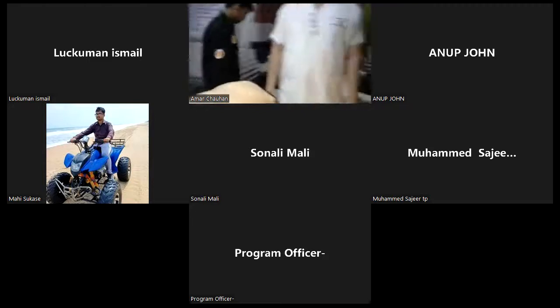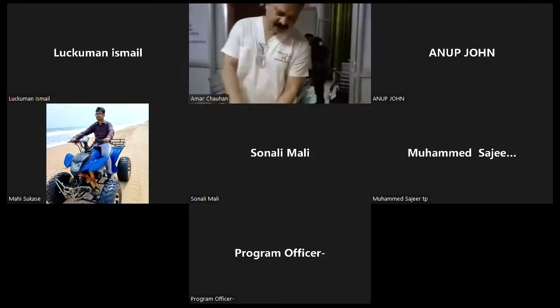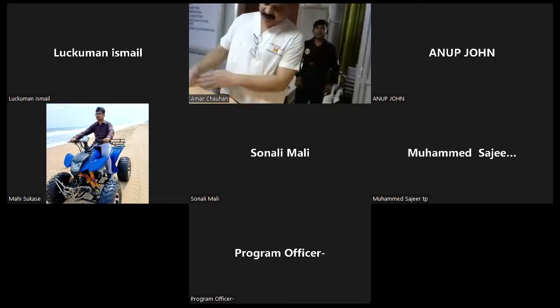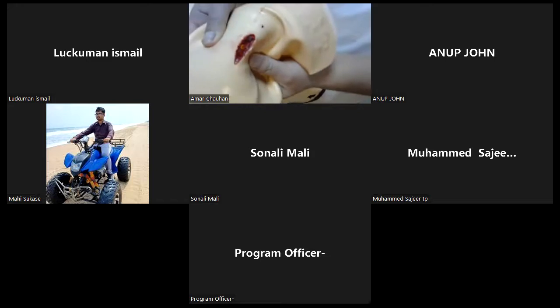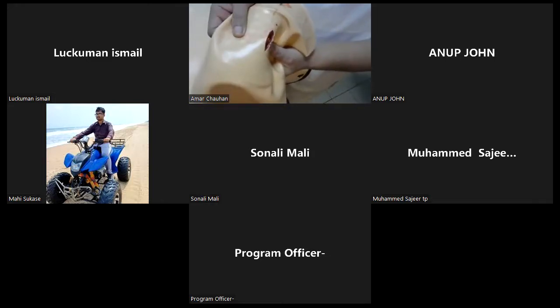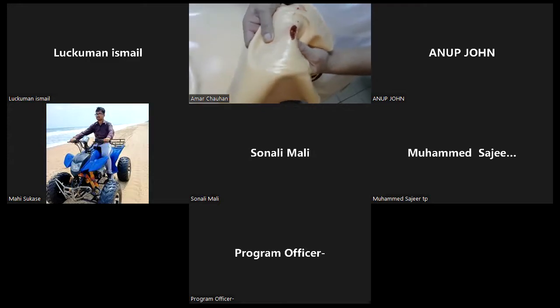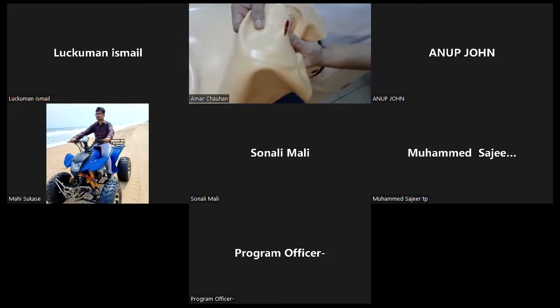Okay. Skin incision, muscle. Yeah. Skin. Yeah. Chest belt, you will give a skin incision like this. This is the skin incision. Okay. There should be a bleeding simulation possibility, right? Pardon? After skin incision, there should be blood simulation, not there.